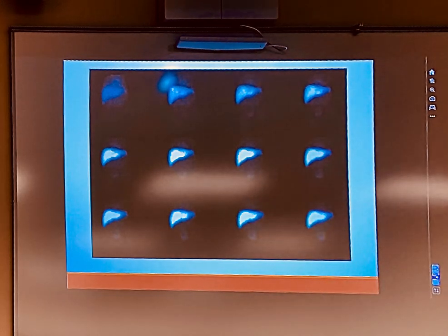Sometimes you'll get a picture and you will, what we call, blow it out, like you'll make it really, really dark to be able to prove something else. So this is probably not the only image that went to PACS. The initial image that went to PACS probably had everything else lighter. This was darker to prove that the baby had bladder activity. So that's liver and bladder that you're looking at.